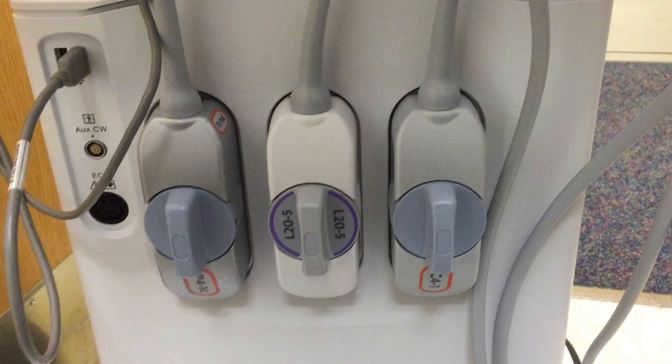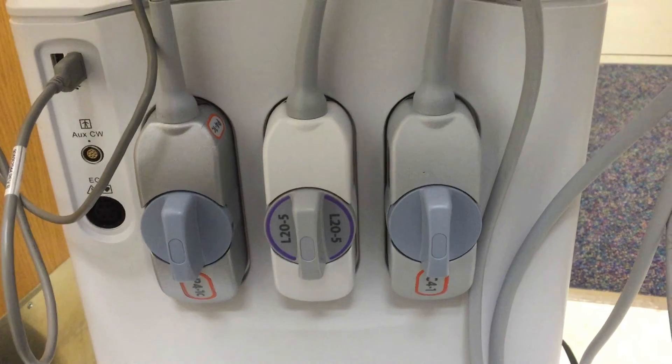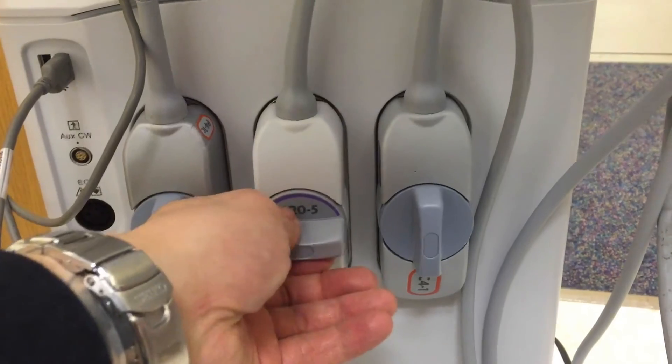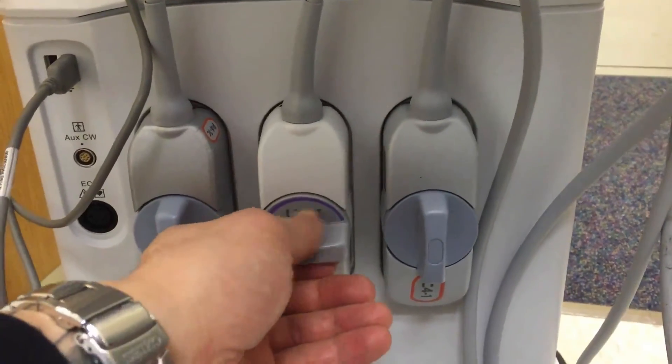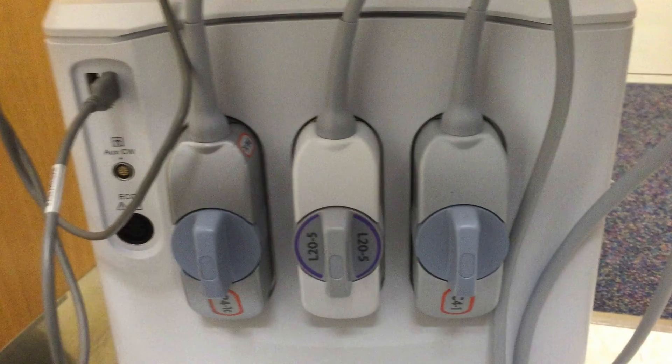First, let's go over how to change the probes. There is the connector at the base of the system. To change the probe, turn the switch and the probe comes off. To replace the probe, place it in the dock, turn the switch, and it locks in place. The probe is now active and ready to be used.